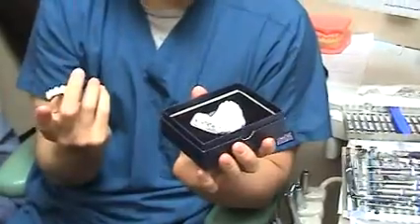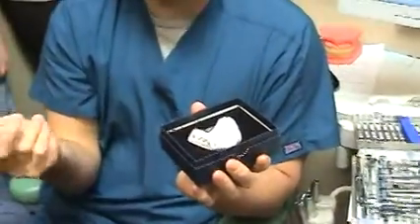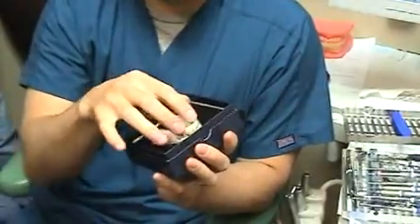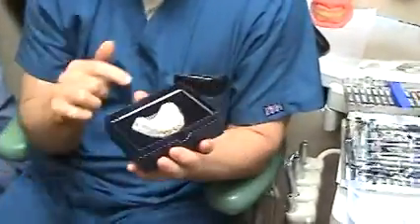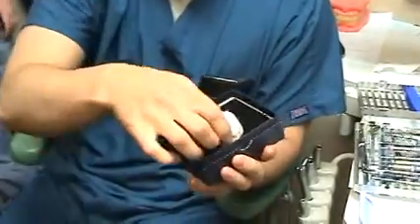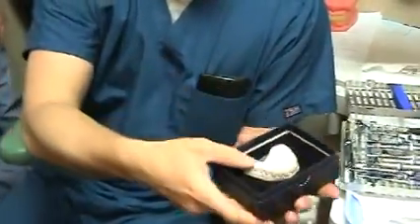We've got the option of a bridge, or implants, or a removable partial denture. Prior to implants becoming available to us in dentistry, all that would have really been available would have been a bridge. So you can take this off and have a look at that and pass it around. Be careful with that one though.